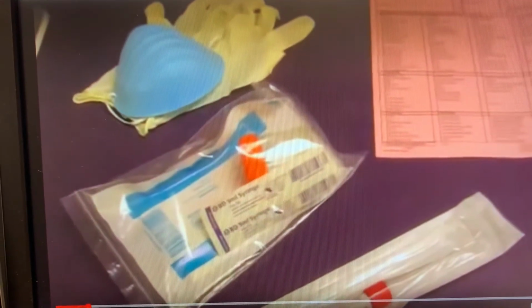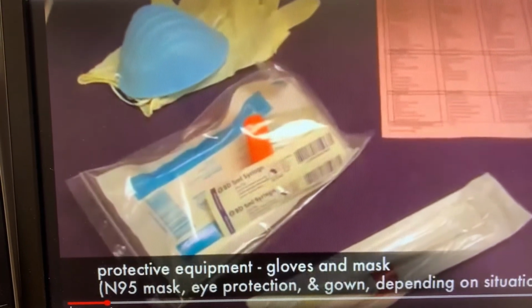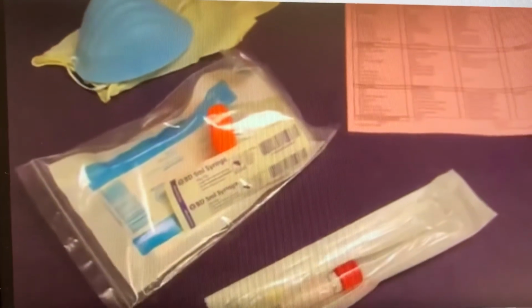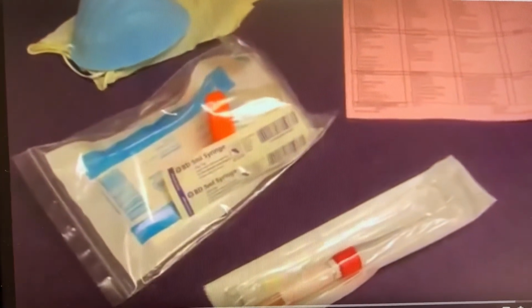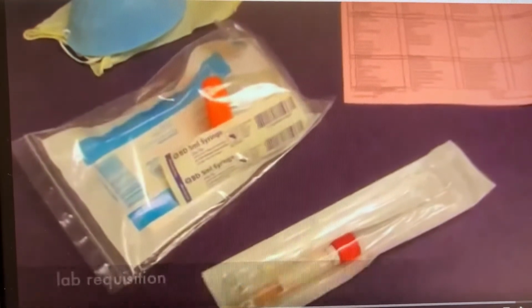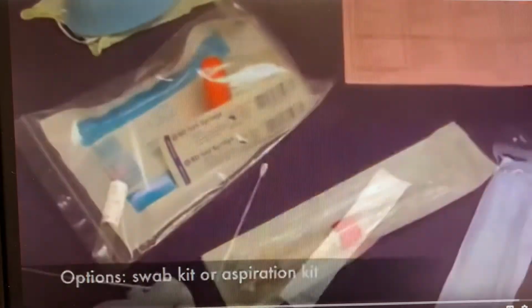Respiratory infections are very common, and diagnosis of viruses such as influenza or RSV depends on collection of high-quality samples from the nasopharynx. To sample the nasopharynx, you'll need protective equipment including gloves and a mask. An N95 mask, eye protection, and disposable gown may be required depending on patient sampled and local infection guidelines. You will also need a lab requisition and either a nasopharyngeal swab kit or an aspiration kit.